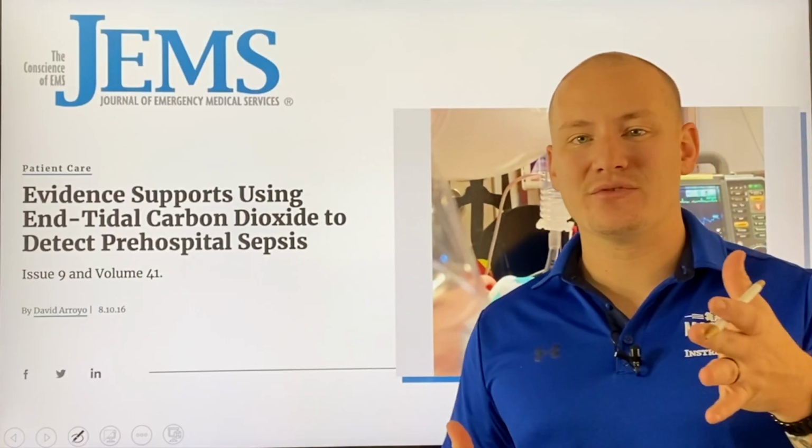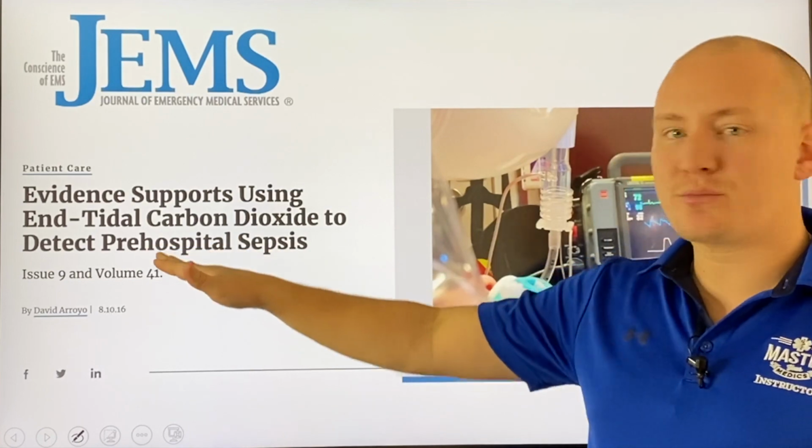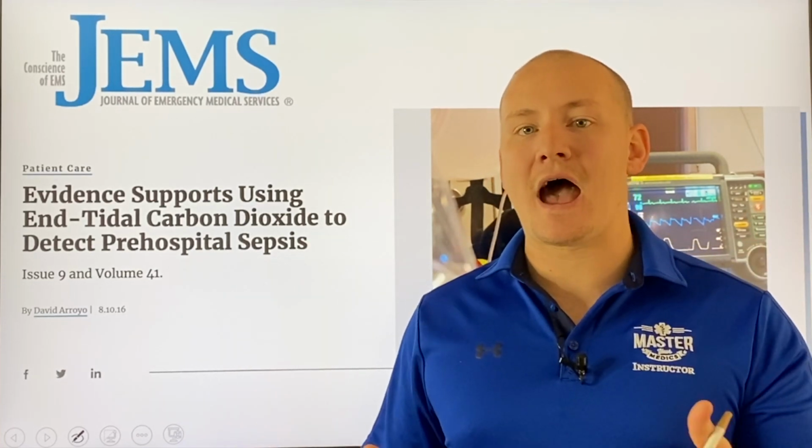Thank you so much for checking out this video on end-tidal CO2 and using it for the detection of pre-hospital sepsis. Remember that end-tidal CO2 is only good if you have a good assessment. So if you have a high suspicion of sepsis and you use end-tidal CO2 to confirm that it is low, then we have a pretty good indicator that we're looking at a septic patient that needs to be taken care of with early recognition and early treatment.